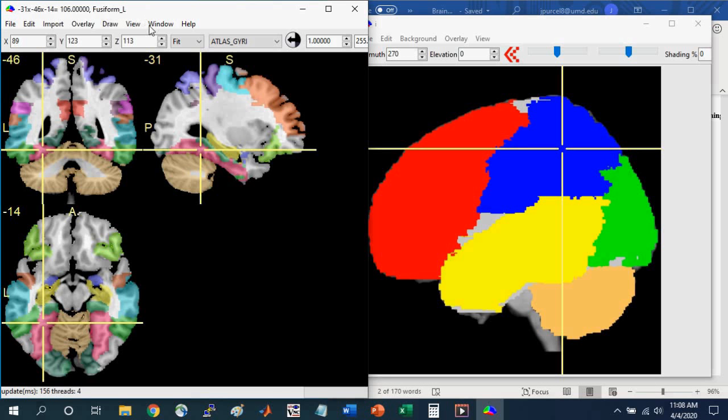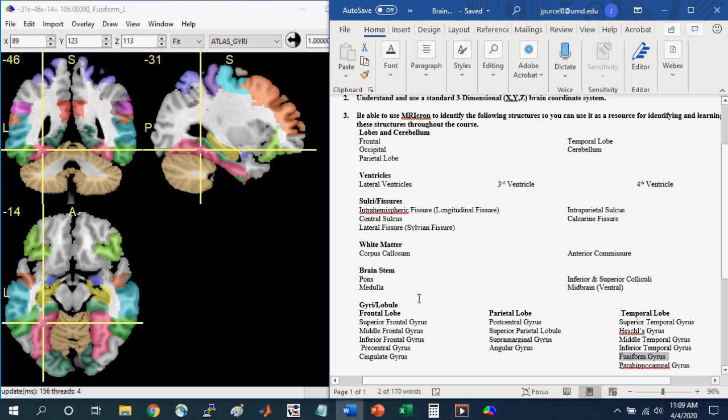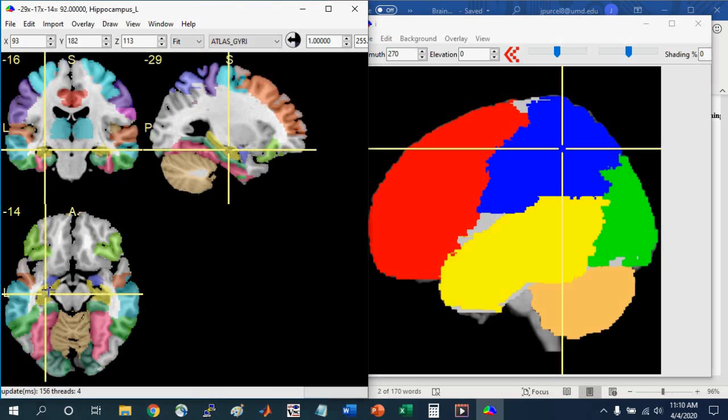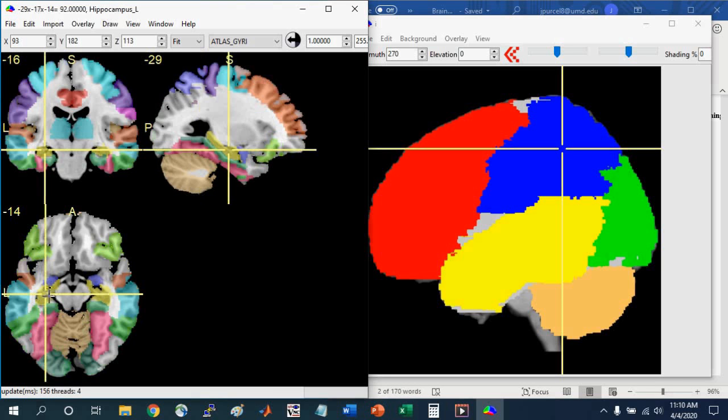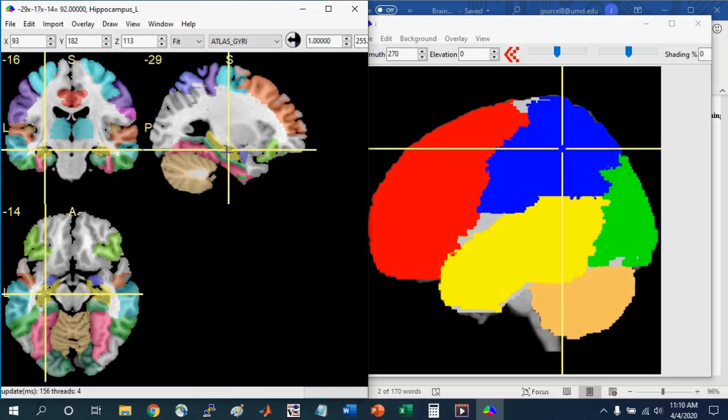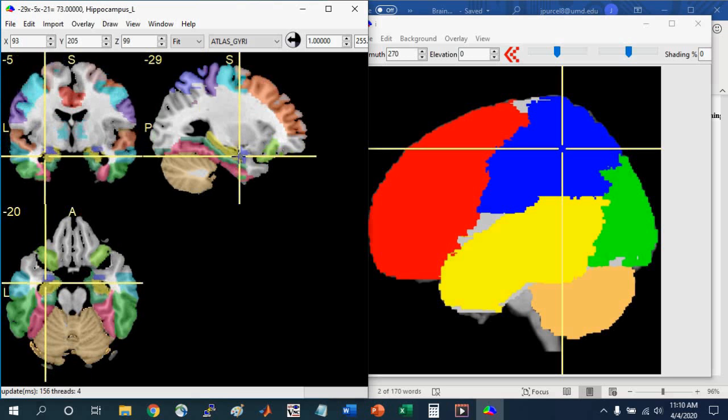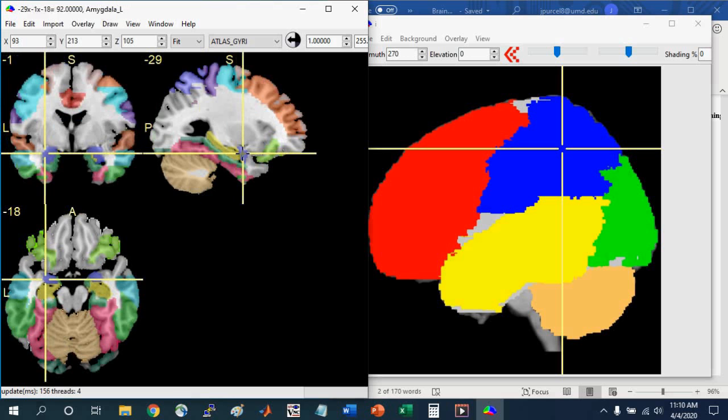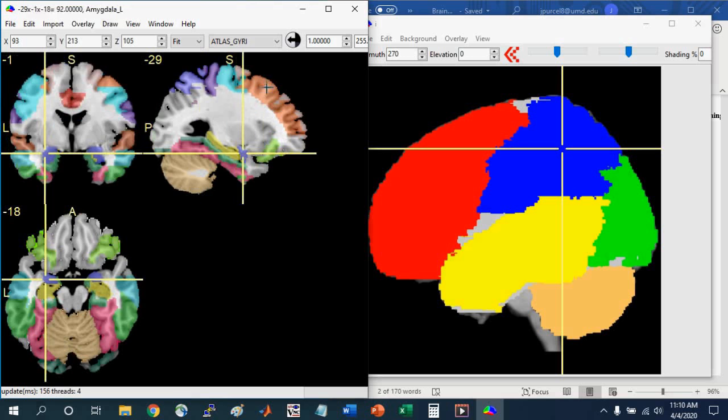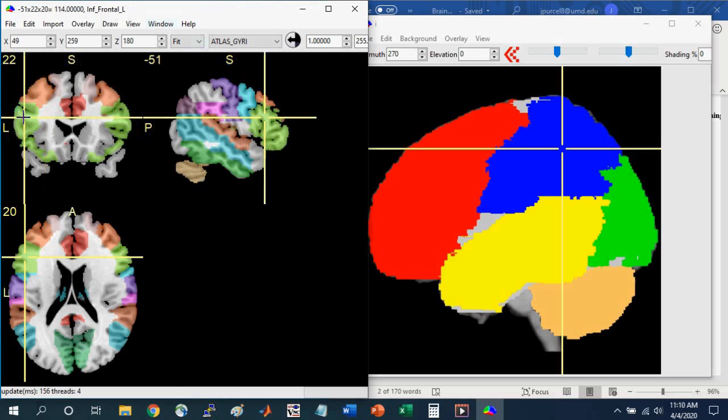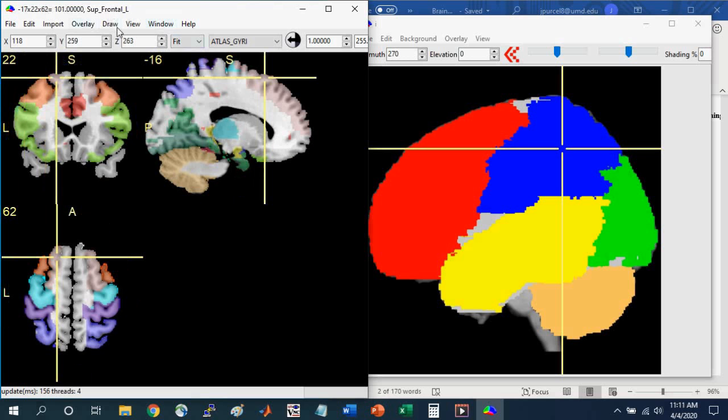So again, you can click anywhere where there's color and identify the different brain regions on this list. For example, I can select this yellow region and see the left hippocampus. And I can navigate to the anterior portion and see that just anterior to it is the amygdala. And I can jump up to the frontal lobe and see that this is the left middle frontal gyrus. So left mid frontal means left middle frontal gyrus. And inferior to that is the left inferior frontal gyrus. And then I can go all the way up to the top and see the left superior frontal gyrus.